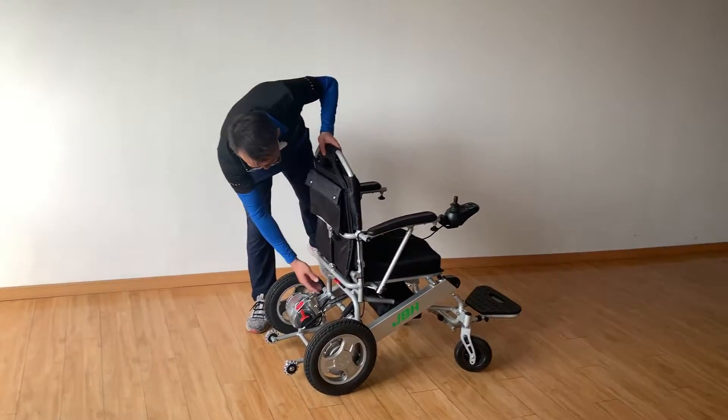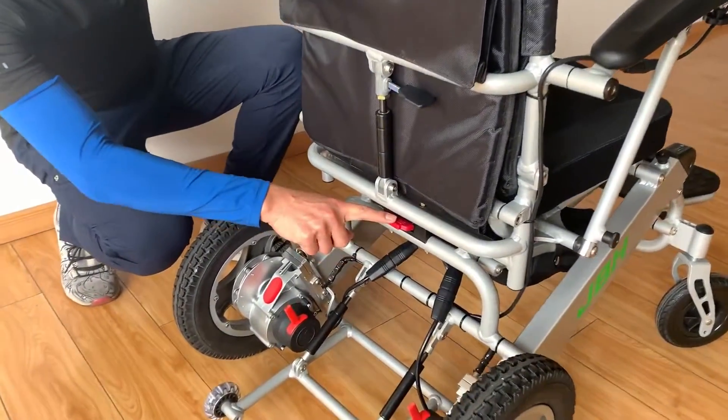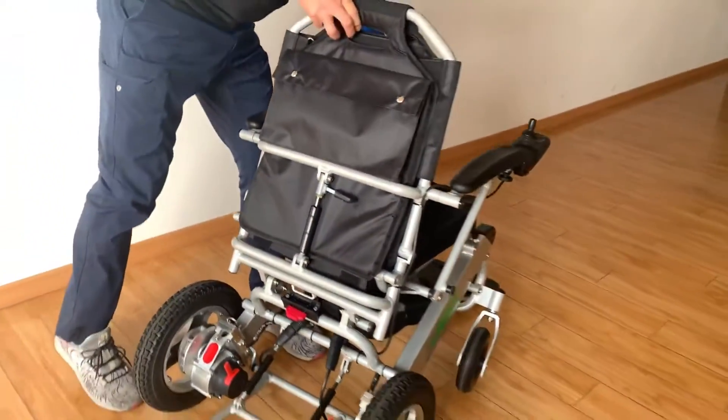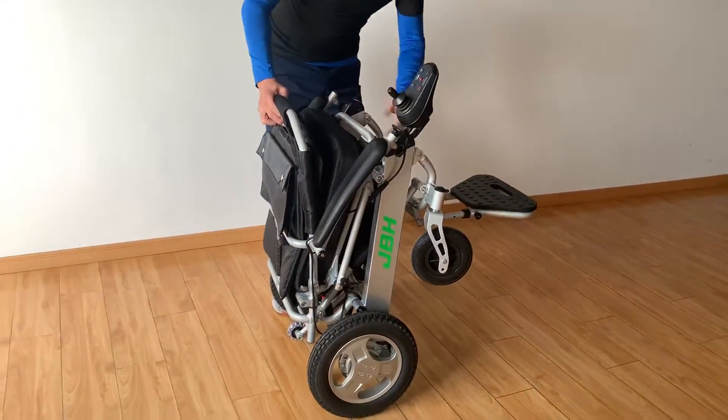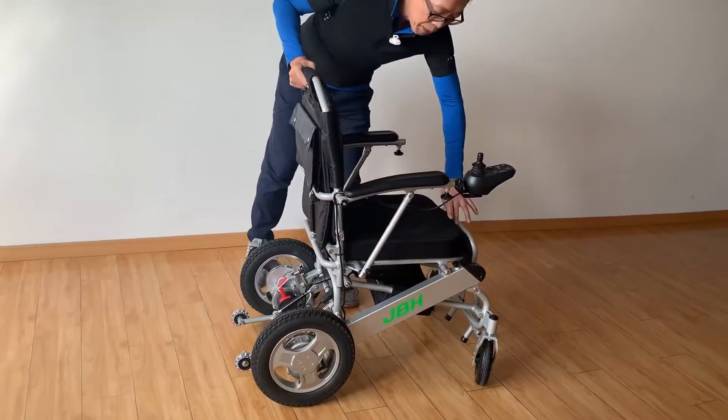First, you can see from here we have a very simple and easy one-finger touch. It's simple and easy.